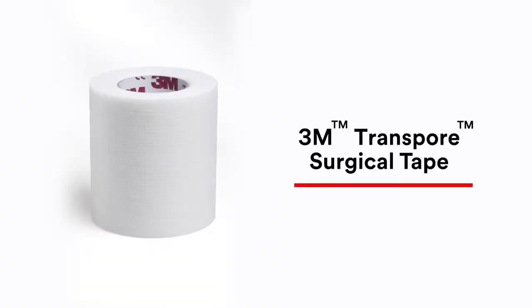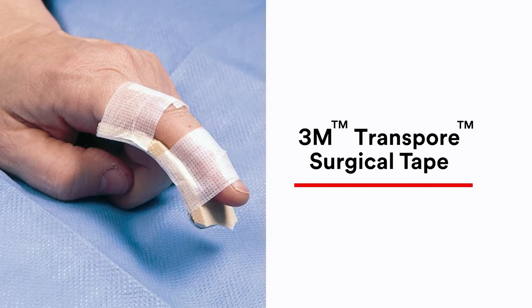3M Transpore white tape, on the other hand, is a gentler tape with moderate to strong adhesion that is water resistant. These characteristics make it perfect for securing dressings to damp skin, securing tubing, or when repeated taping is necessary. Well, now recently 3M introduced a new tape, one which uses silicone adhesive on a paper backing. Now, what makes this tape different, Jen?